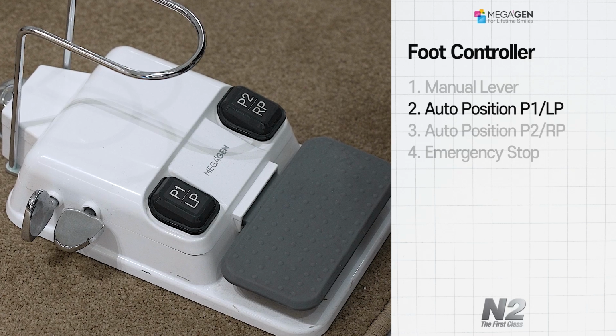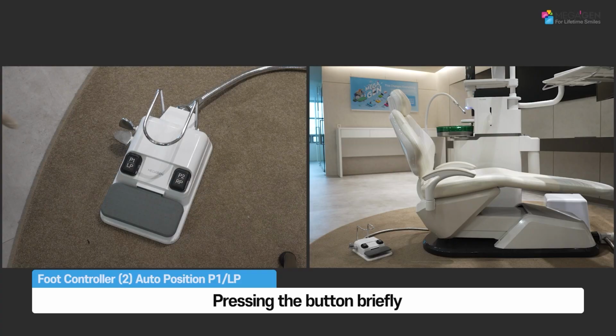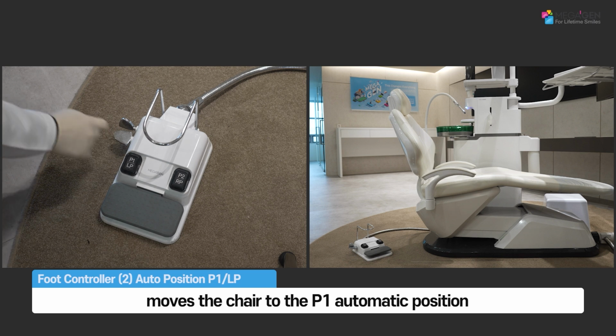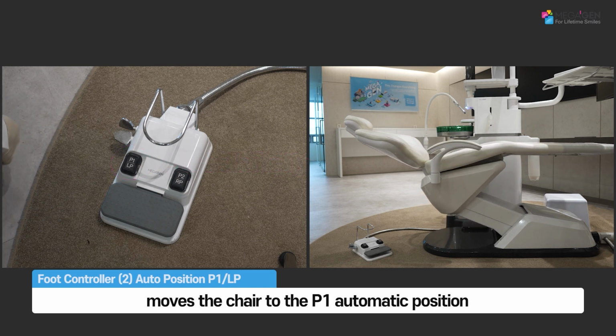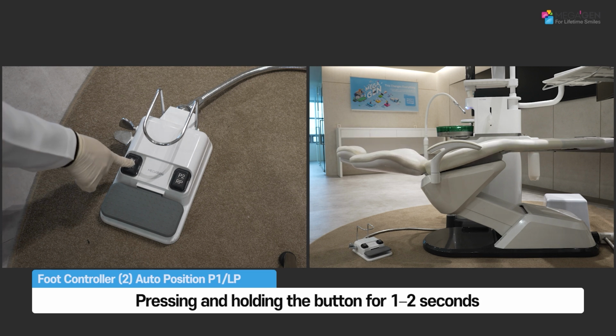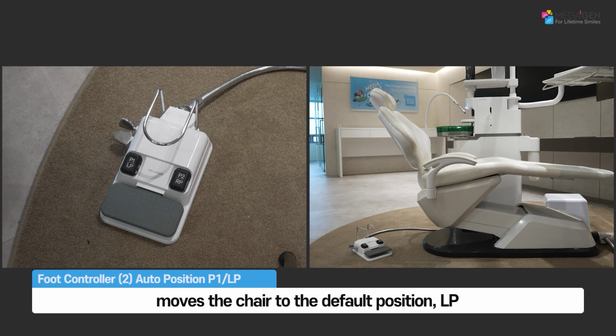How to use the foot pedal automatic position P1 LP buttons. Pressing the button briefly moves the chair to the P1 automatic position. Pressing and holding the button for 1 to 2 seconds moves the chair to the default position, LP.